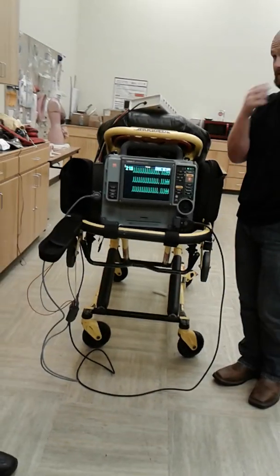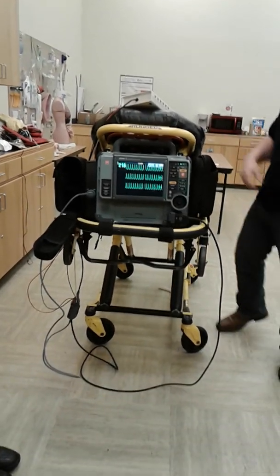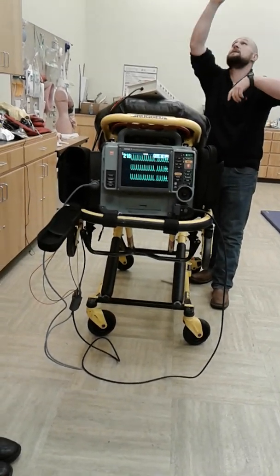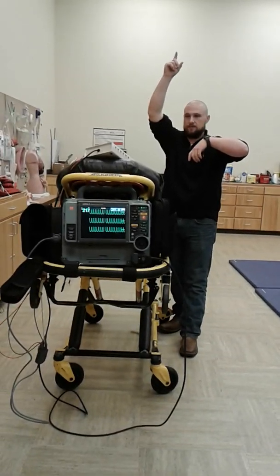What's my dose? First dose of adenosine? 6 milligrams. Rapid IV push. This is the one where you start that line. You got this hub right here. You got your adenosine lined up in this hub. You got a flush lined up in this hub. You got an IV bag hanging with a blood pressure cuff on it.